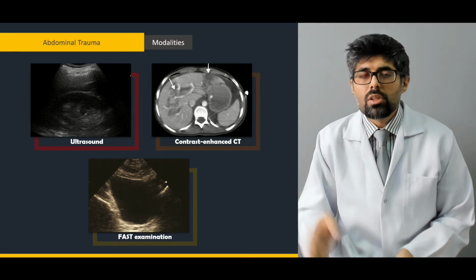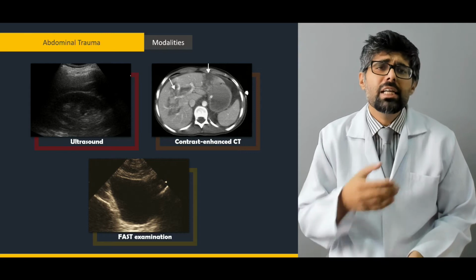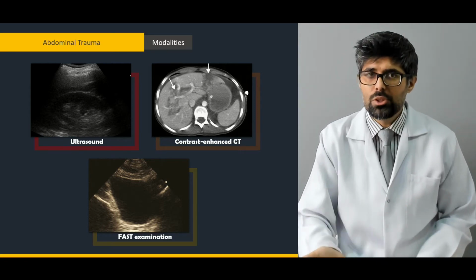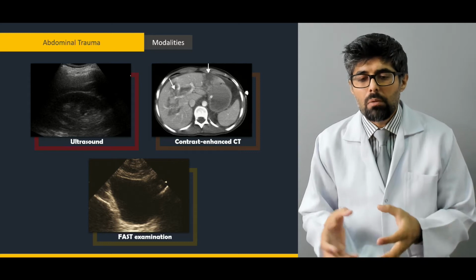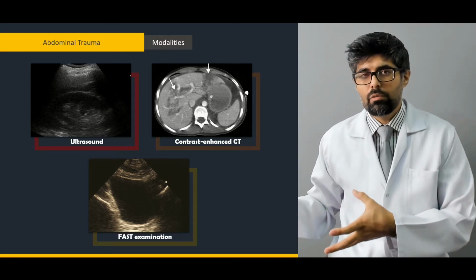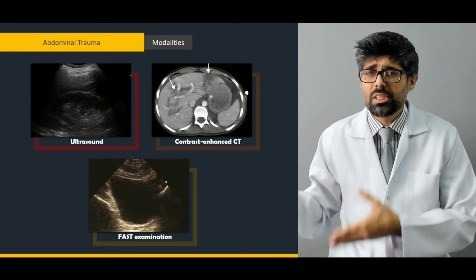Now, ultrasound is a very quick and very easy to do modality. It can be done in an emergency department. It does not require very high level equipment, but it usually has a probe and some kind of processor and a monitor with a display.